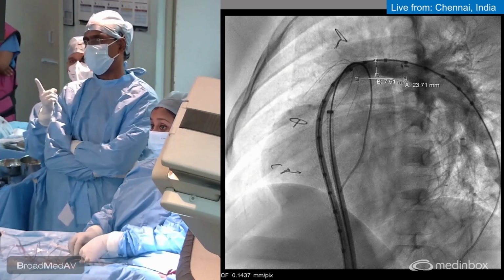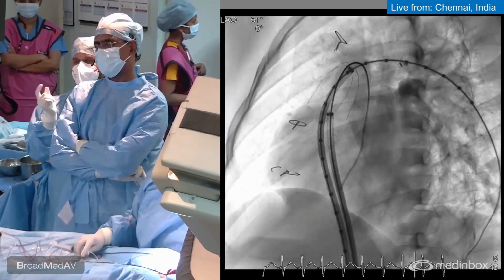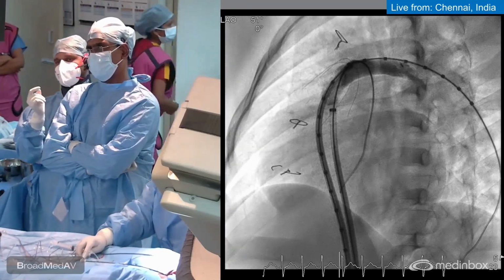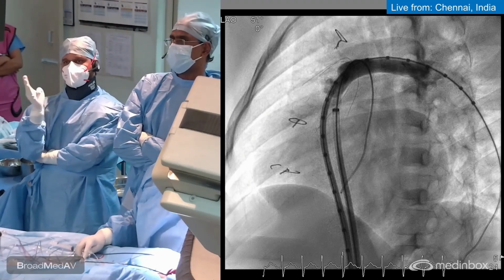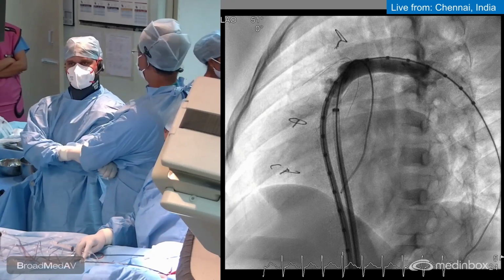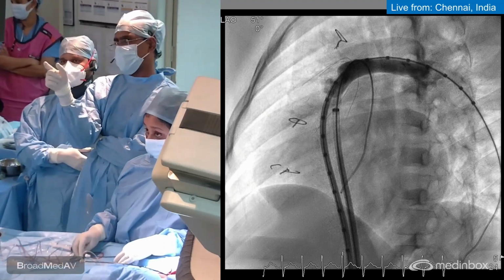The length is probably again wrong here. Can you show that angiogram again? Can you freeze the image and show? Go back a couple of frames. Correct. Next frame. Correct. So here, if you see, again 4 markers, it's almost 3.5, more than 3.5 markers. So I'm considering, shall we consider a 10 into 4 here? 10 into 4 should be fine, because of the length.